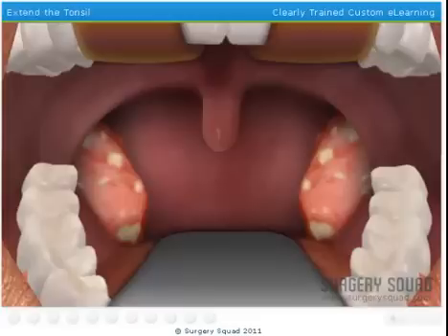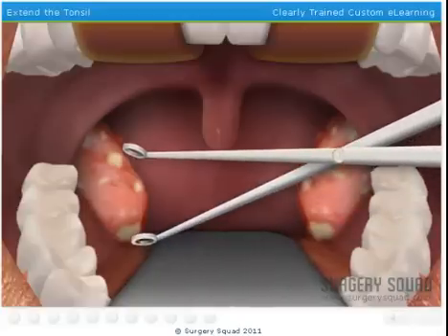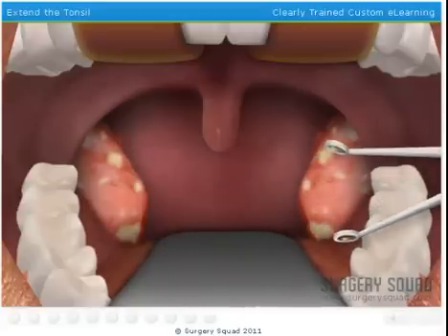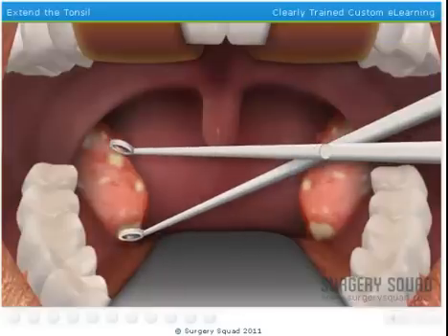Now we have to reach in and grab the infected tonsil with the tonsil forceps. We need to pull it to the side to expose the connective tissue. Can you do that for me? Nicely done!